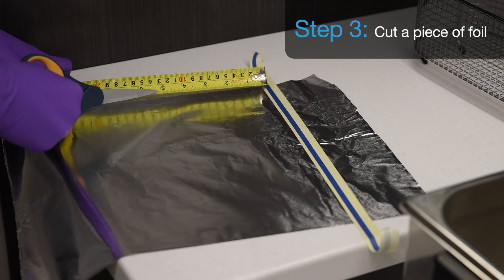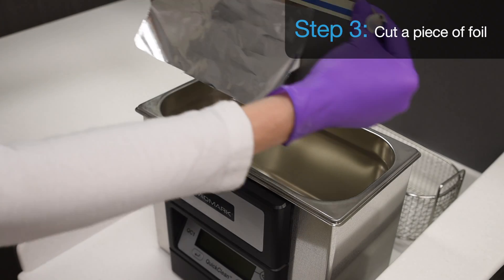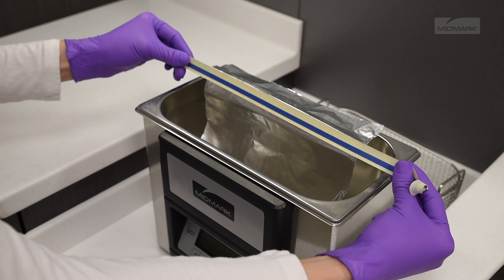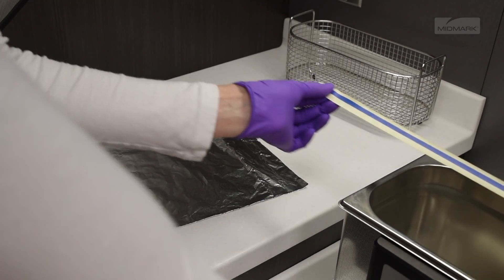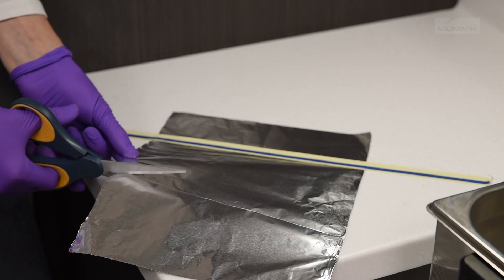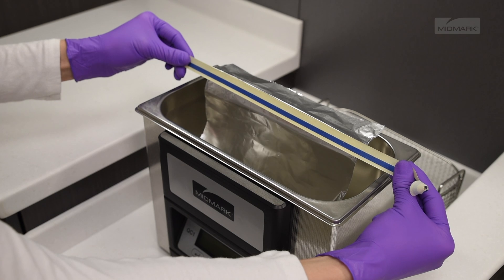Step 3. Cut a piece of foil approximately six inches in length and long enough to attach to the support and suspend almost to the bottom of the tank. The foil must not touch the bottom or sides of the tank. Attach the foil to the support. Care should be taken to avoid crinkling of the foil. Cut the aluminum foil if needed so that it will fit the tank without touching. Check the length.